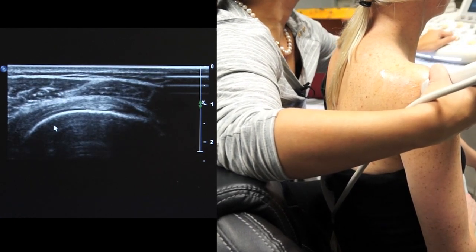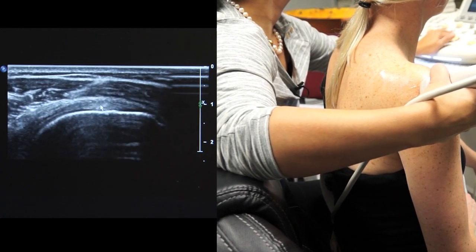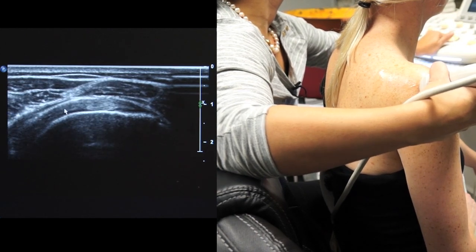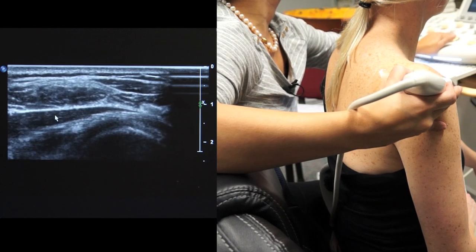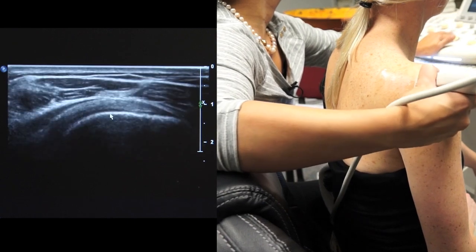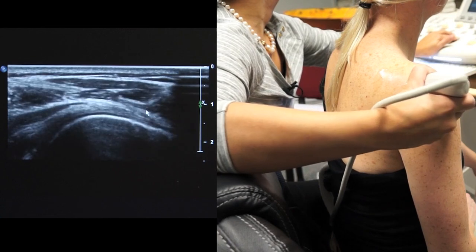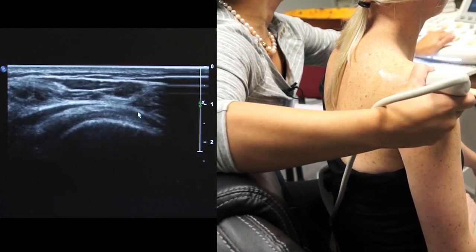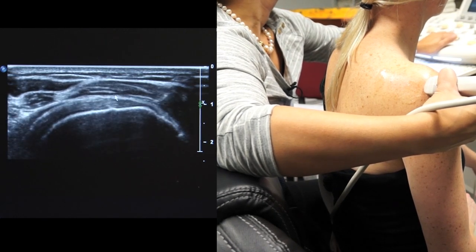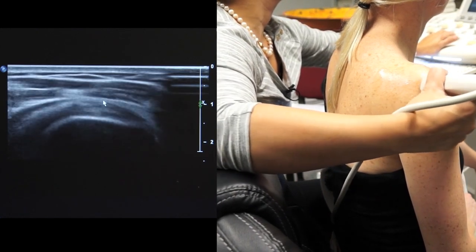I'm going to adjust my depth. And here you can see the parallel echogenic lines, which represent the collagen fibrils of the infraspinatus tendon. And you can see here's the myotendinous junction, the hypoechoic muscle, the tendon which is hyperechoic, and the tendon coming in towards its insertion. If there's anisotropy, you just reorient the transducer to bring the tendon fibers perpendicular to the beam. The subacromial subdeltoid bursa sits on top of this, and it's a potential space, so we don't see it here.